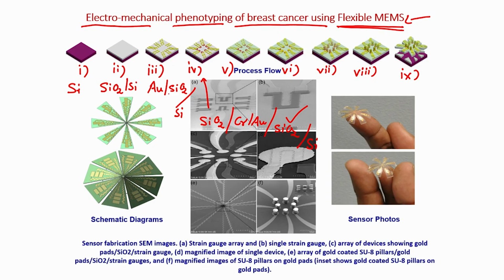And how do we do that? You know it, right? So, for patterning this we are using a photolithography technique. That means that we will deposit chrome gold, and then we will pattern chrome and gold with the help of photolithography. All right.